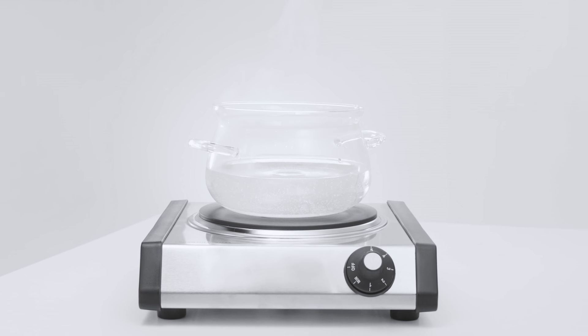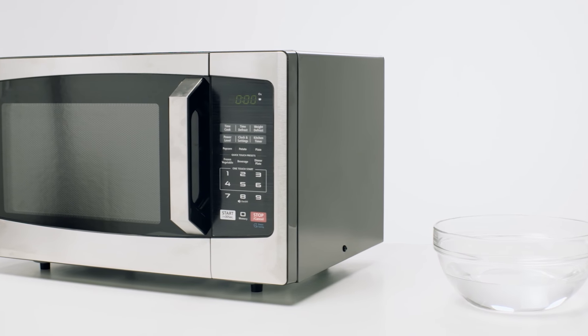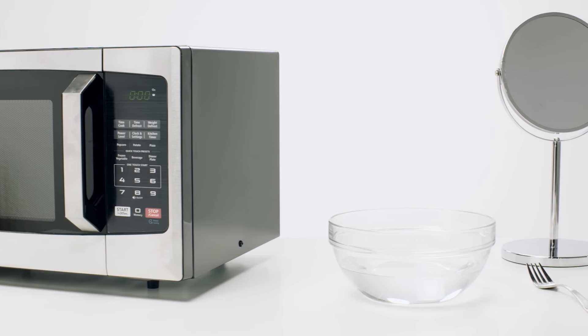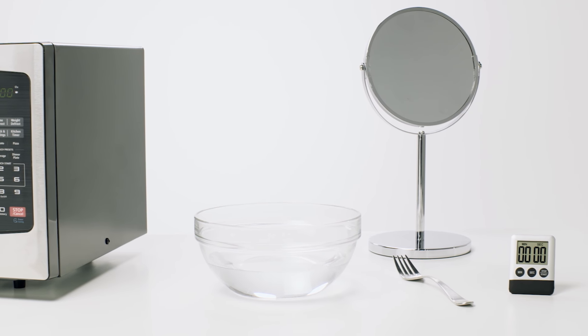The preferred method is to use a stove and a pot of water. If you don't have that, a microwave and a microwavable bowl works too. In either case, you'll also need a metal fork, a mirror, and a timer.